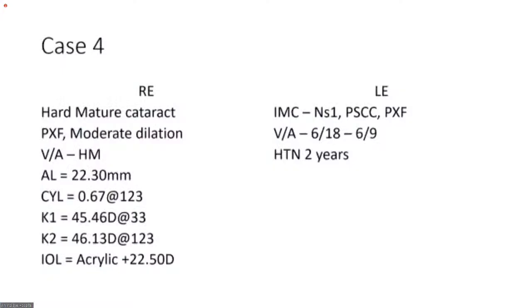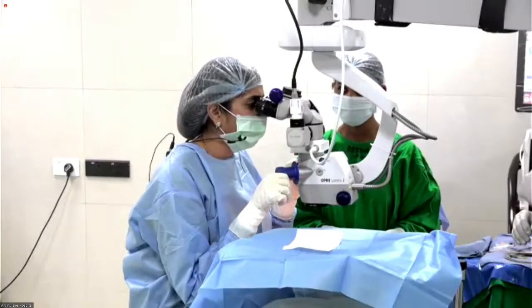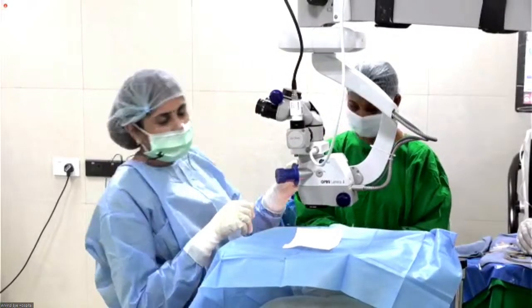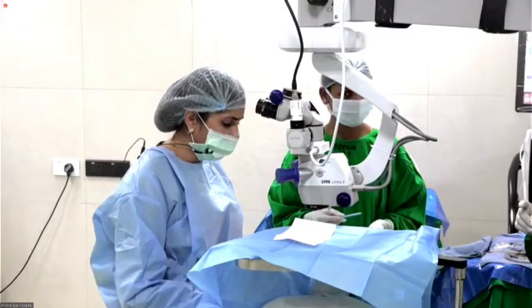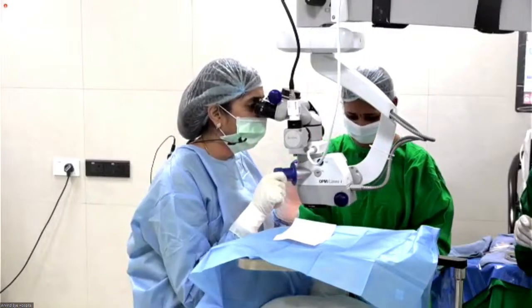And this is a monofocal lens? Yes, it is a monofocal lens. Okay. So I'm actually a little skeptical on doing multifocal if I don't know how the back of the eye looks. Normally we do an OCT in all these patients. But if a patient really is keen on a multifocal, then we would do it. But otherwise, we normally would recommend a monofocal.